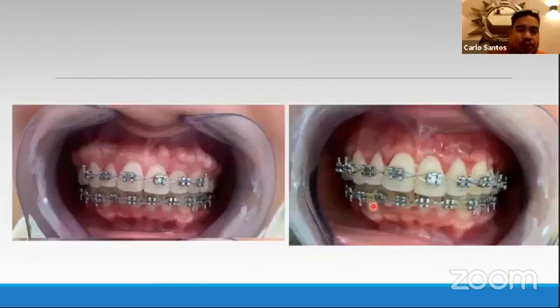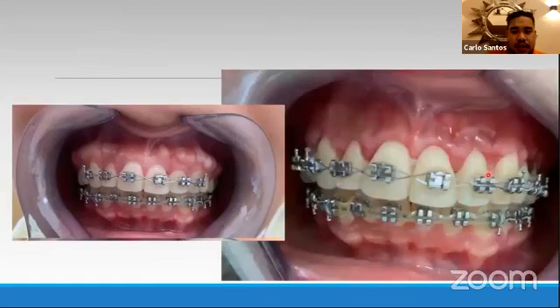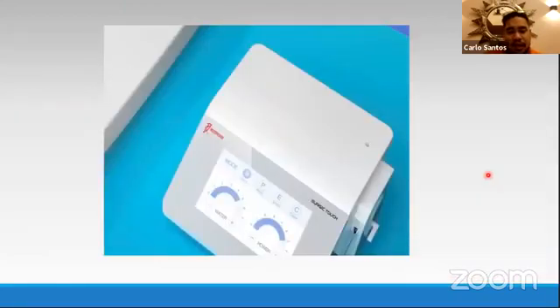So bony exostosis, you see the exostosis here, but the patient actually doesn't want it. This is actually a dentist also, one of our colleagues, Dr. Melody. As you can see here, it's greatly reduced, so she's happy with it.